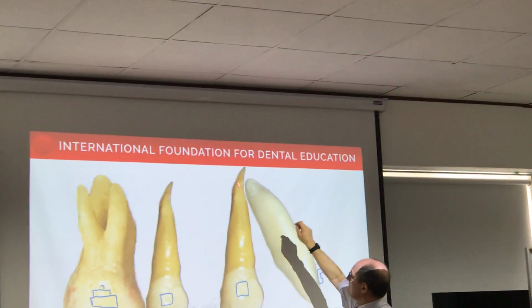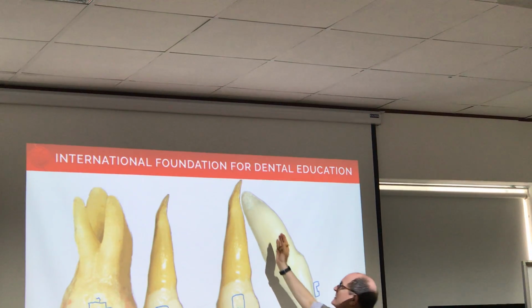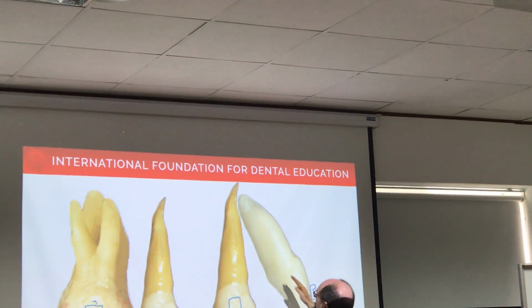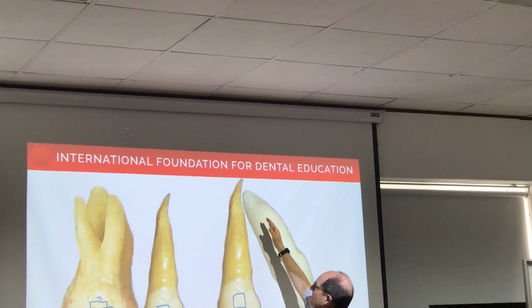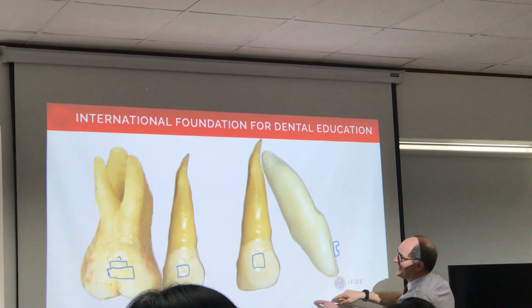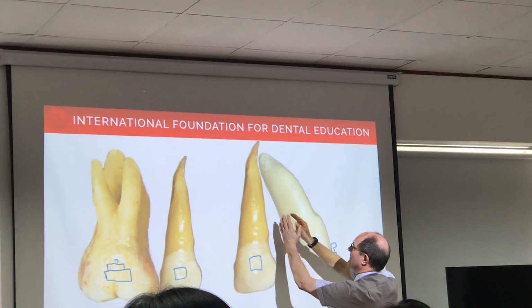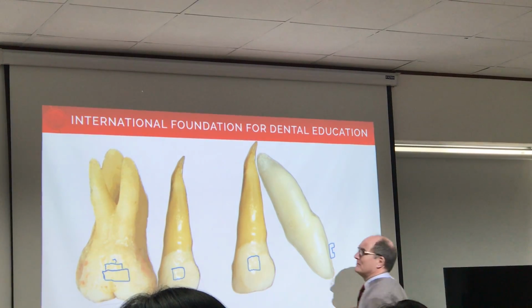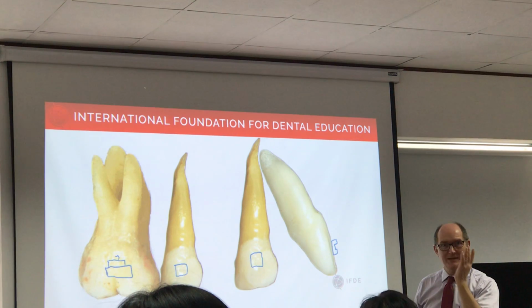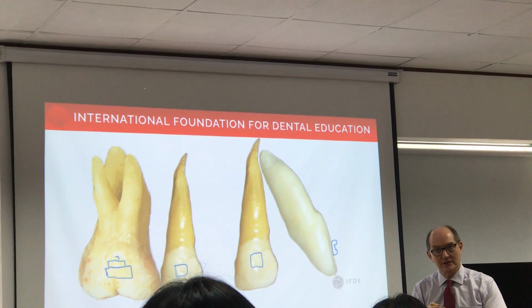So my thinking here clinically is I want to make sure that I get that root moved a little bit distally, giving me more room to be able to lift these guys up, because often these incisors are down here. Okay, I want those guys to come up and back. This guy may be in the way, he may be buccal, he may be palatal, he may be tipped and halfway on each. So I need 3D to find out.